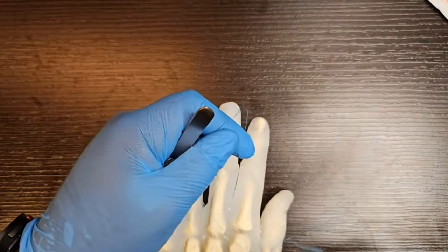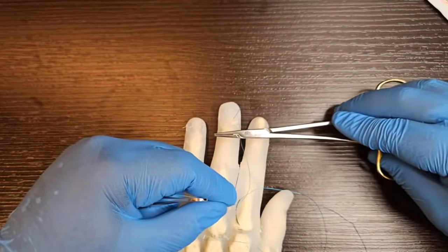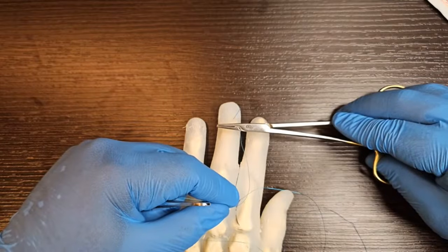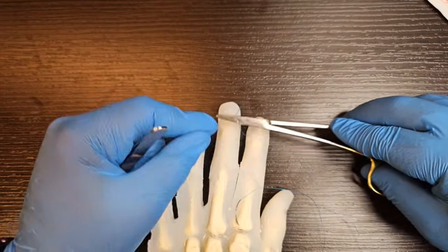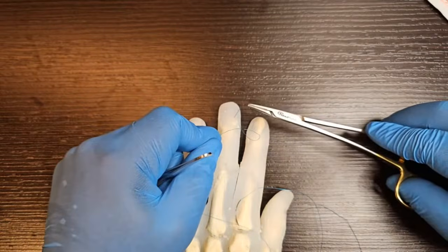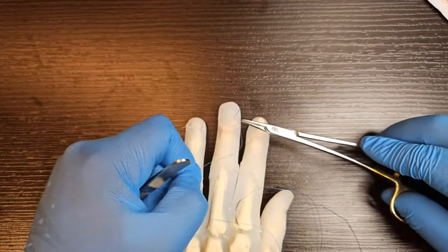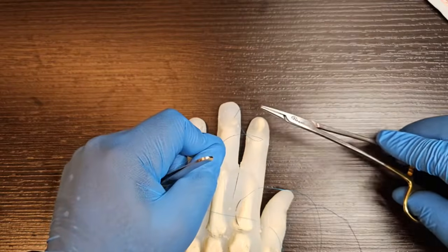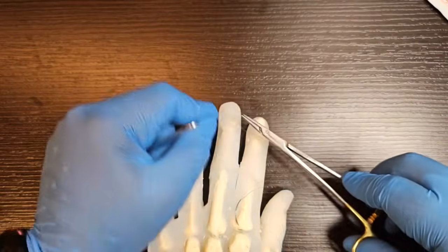Forceps palmed. Needle holder parallel to the wound. Needle holder in between long and short. In the last session we talked about how to make your maneuvers small and neat and economical. You just have to push the nylon suture like this. Or any suture. Again, I would normally use a dissolvable suture.